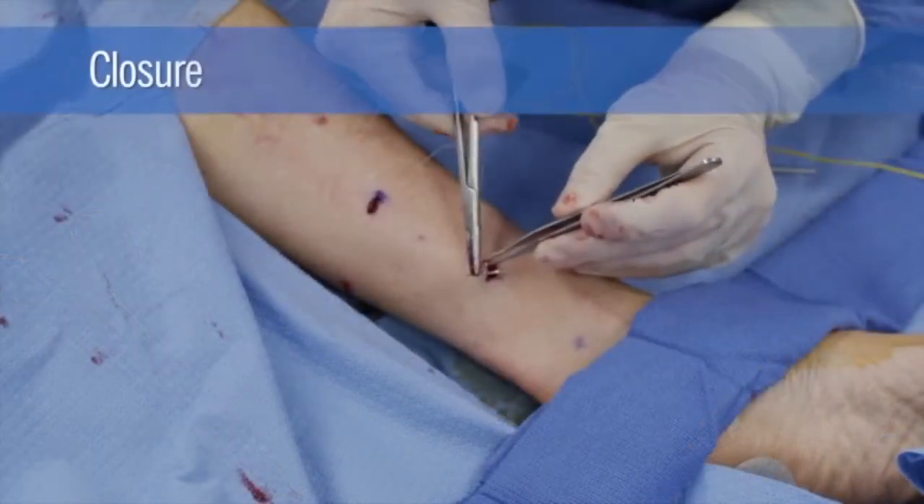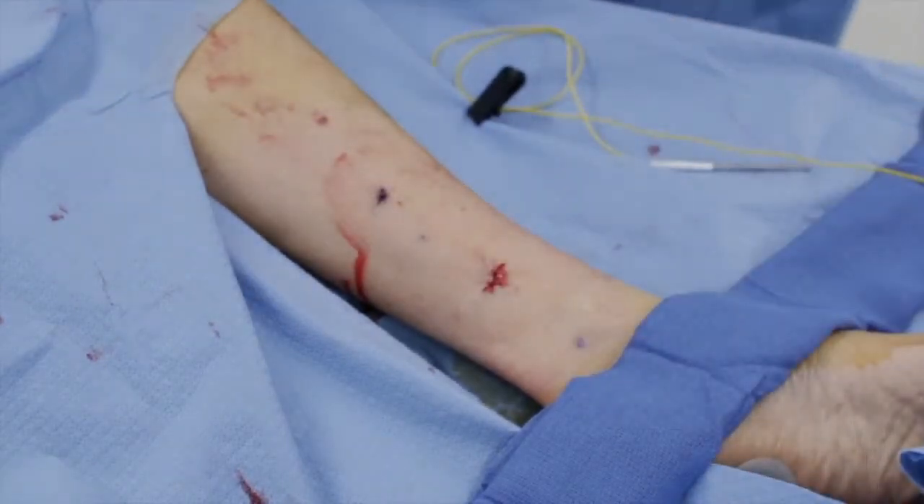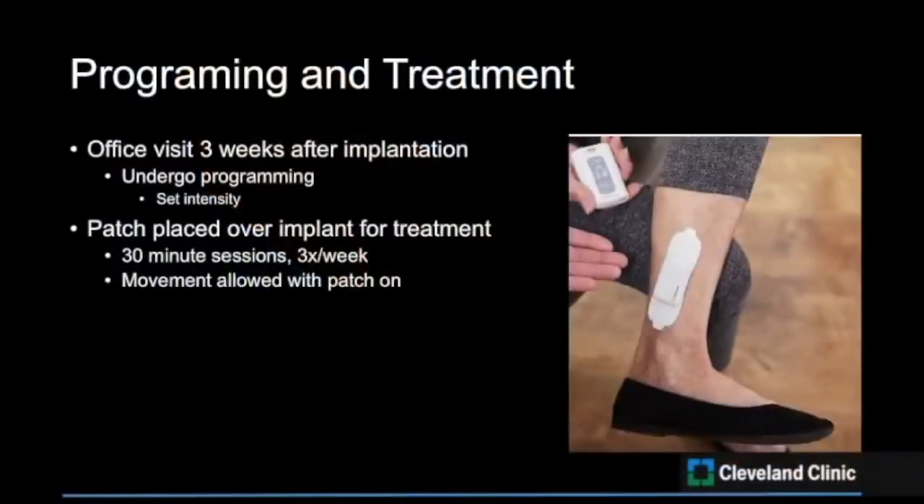The receiver may be pulled back slightly. The incisions are cleaned and closed with 4-0 absorbable suture. The patient is sent home with a three-day course of antibiotics. Three weeks after implantation of the tibial nerve lead, the patient is seen in the office to undergo programming. After programming, the patient may begin their treatment regimen.